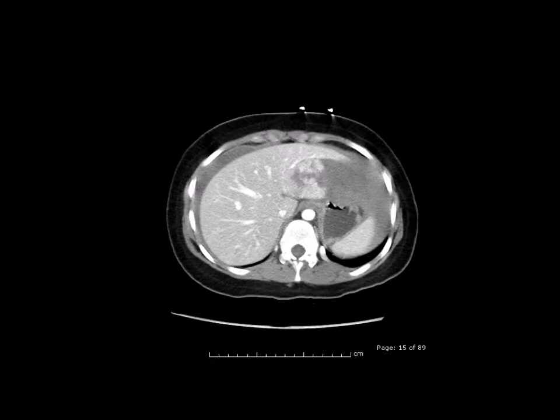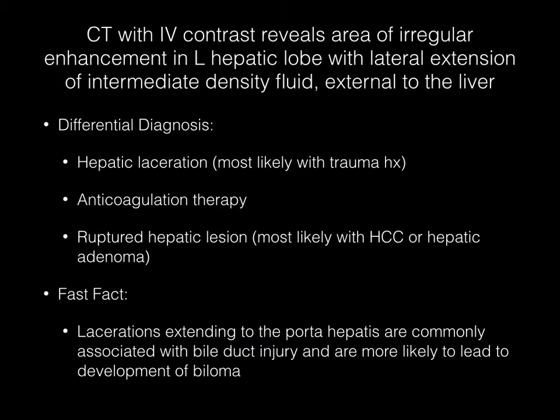Now pause your media player. This axial CT image with IV contrast enhancement reveals an area of irregular enhancement in the left hepatic lobe with lateral extension of intermediate-density fluid external to the liver. The differential diagnosis includes hepatic laceration, which would be most likely with a trauma history, bleeding due to anticoagulation therapy, or a ruptured hepatic lesion, which most typically occurs with HCC or hepatic adenoma.